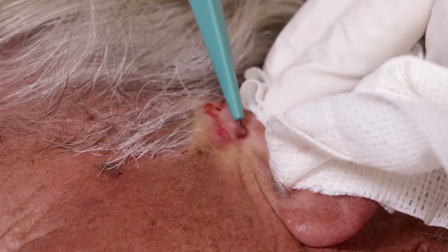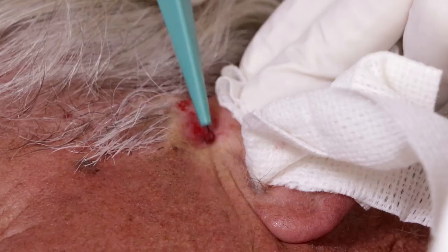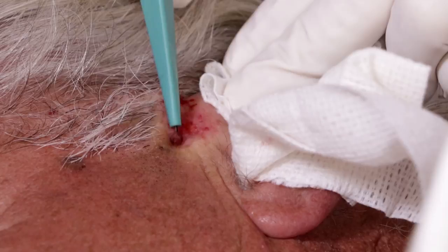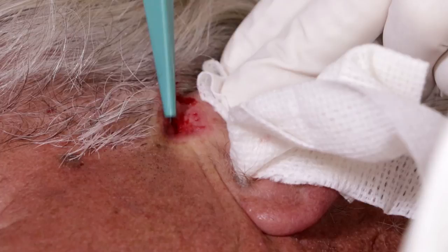There is a feeling the operator — that being me — can feel when going over cancerous tissue; you can feel it coming off. I'm going all the way to the edges. You can feel that roughness, that scratchiness, and then it goes away as you get it off. That tells you where the cancer is and where it isn't. Pretty cool. You can tell it goes smooth when you do get it all.